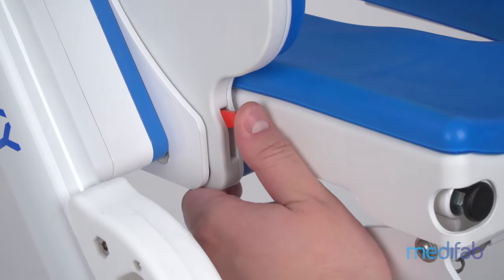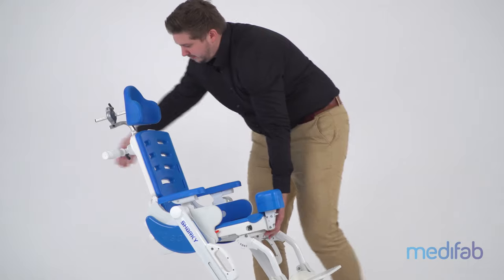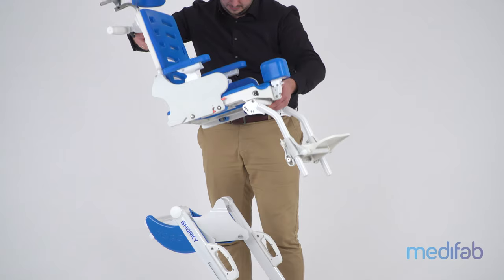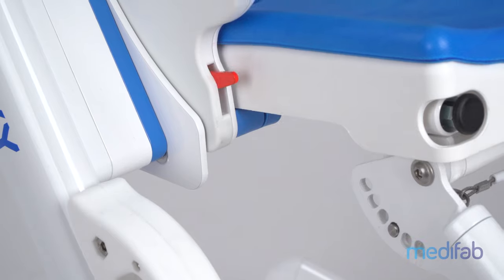Regarding the detachable seat, it can be easily removed from the base by using quick-release levers. When it is reinstalled, the seat audibly clicks into place.